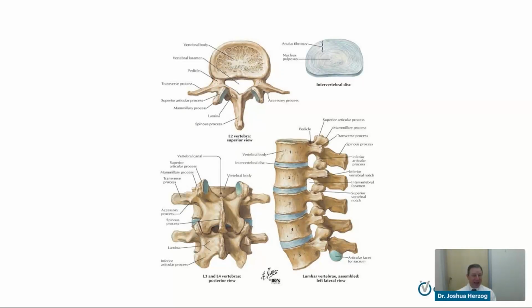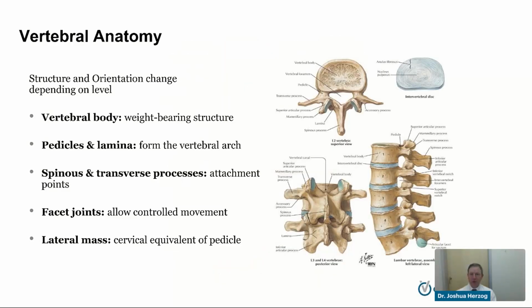But knowing the bony anatomy dictates and shows us where we need to dock, because we're going to use the x-rays to show us where to put those tubes. And then through the tube, once we start to see the visualization of the bone or the ligaments or the muscle or the nerves or the discs, we work systematically to get the nerve decompressed, or to get the area opened, or to get the nerve removed that's generating the pain.